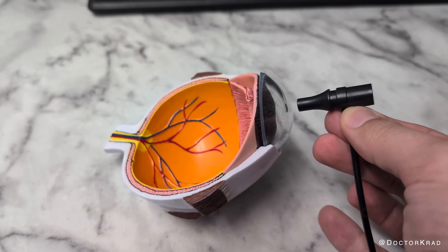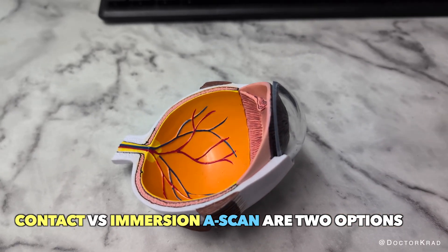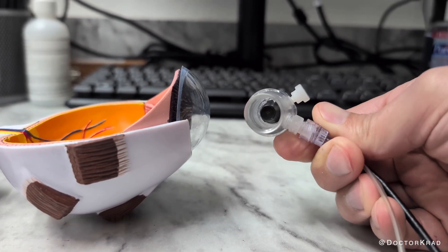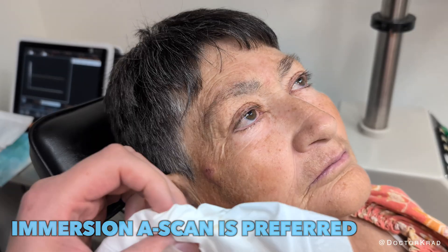Ultrasound can be performed by touching the front of the eye with a probe, or even better, by immersing the eye in a water bath and then placing the probe in the water, without having the probe actually touch the eye. There's no indentation of the cornea. This is called Immersion A Scan.